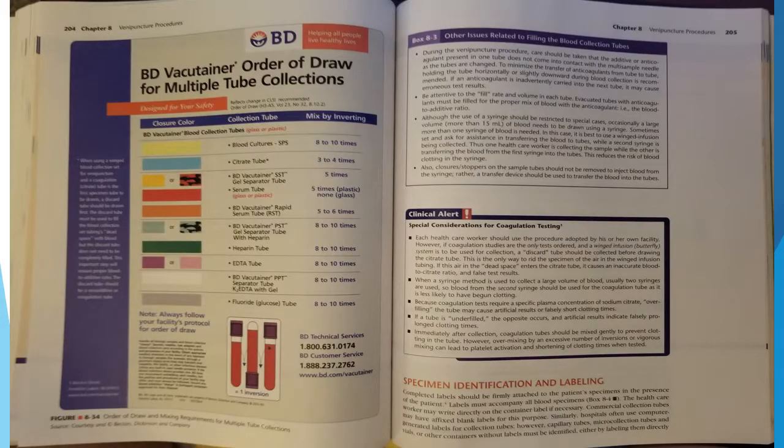On page 204 is a chart with the order of draw for multiple tube collections. Other issues related to filling the blood collection tubes. During the venipuncture procedure, care should be taken that the additive or anticoagulant present in one tube does not come into contact with the multi-sample needle as the tubes are changed. To minimize the transfer of anticoagulants from tube to tube, holding the tube horizontally or slightly downward during blood collection is recommended. If an anticoagulant is inadvertently carried into the next tube, it may cause erroneous test results.